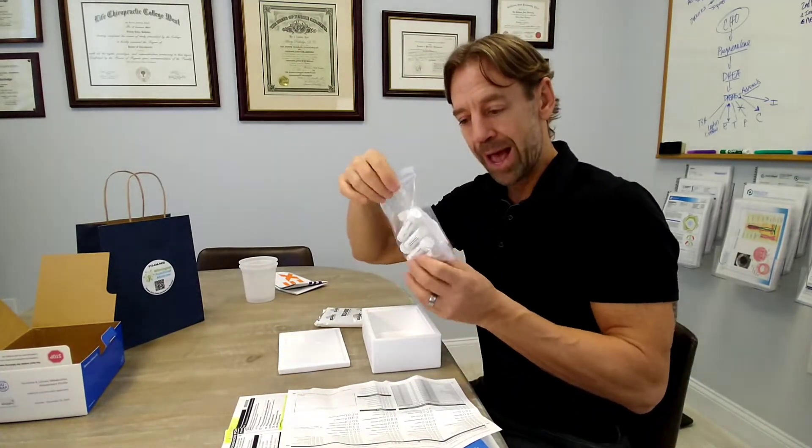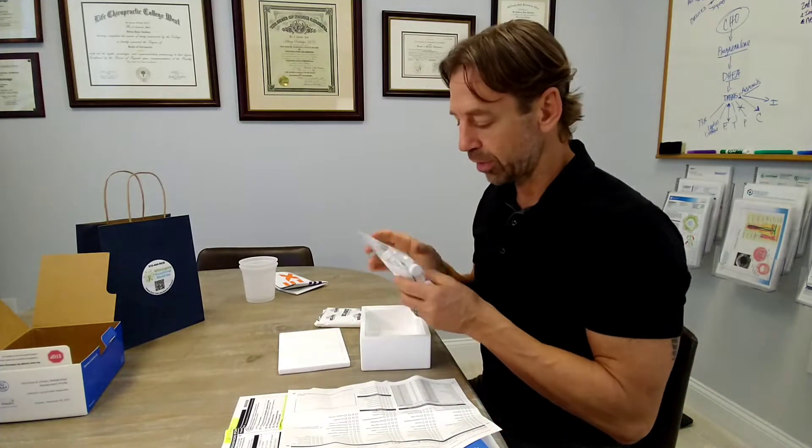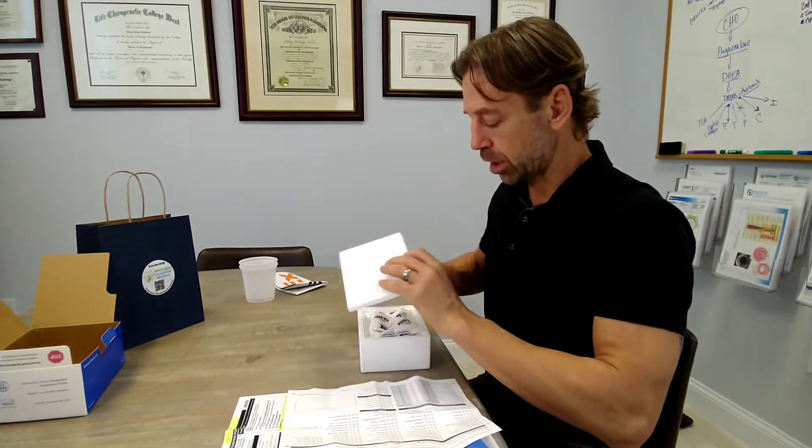There's also a Ziploc bag with some pipettes and some test tubes. Make sure all of that is in there. This bag should contain five pipettes and five test tubes, so count through them. If anything is missing, call us and we'll get you a complete kit. Make sure all these parts are present before proceeding.